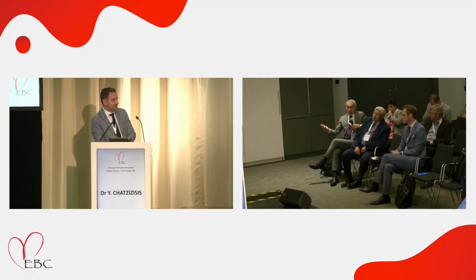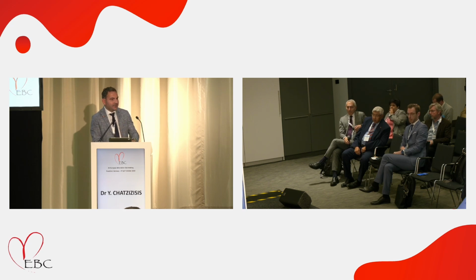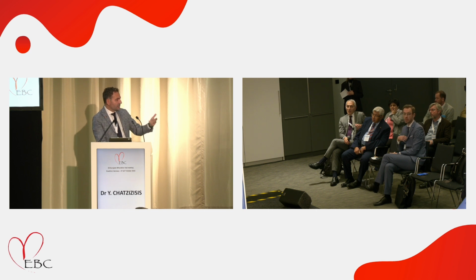Both happen, but primarily all the material properties, the individualized tissue stiffness, are embedded in the model, and then you let the computer essentially tailor the right therapy, the right sizing, the right length, the right approach for each individual. Because of the computer power, it can run multiple scenarios very quickly and recommend what would fit best for this particular wall stiffness, this particular material, this particular anatomy.